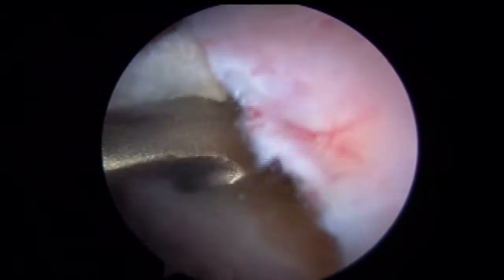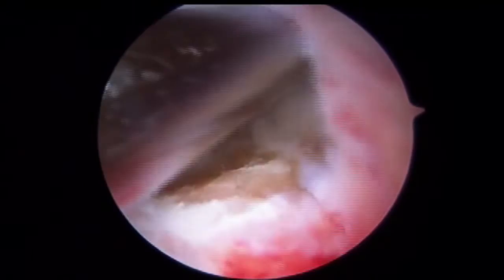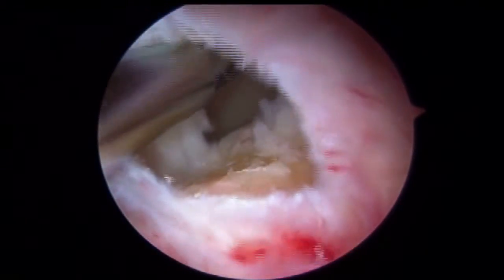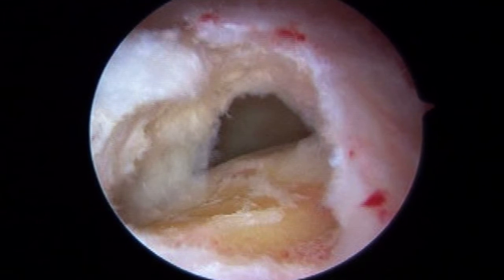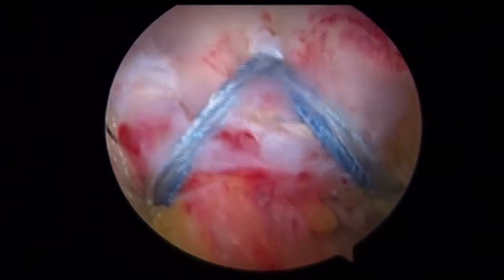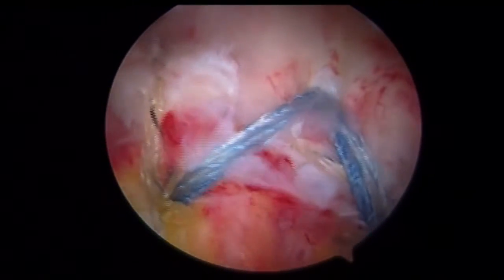A curette and probe are used to ensure that all calcific deposits are removed from within the rotator cuff tendons, and the shaver is used to excise all deposits from the subacromial space. Following excision, the surgeon must decide on treatment for the remaining rotator cuff. In most cases, the calcific deposits only occupy a small portion of the rotator cuff, and simple debridement is adequate. However, in this case, the deposits were incorporated into the entire thickness of the supraspinatus and infraspinatus, which left a moderate-sized full-thickness tear requiring rotator cuff repair. For moderate to large rotator cuff defects following excision of calcific tendinitis, a knotless, self-reinforcing double-row technique is utilized.